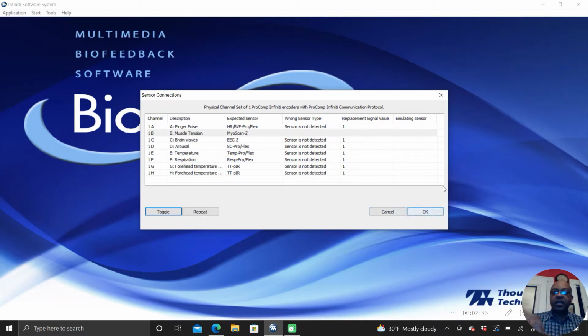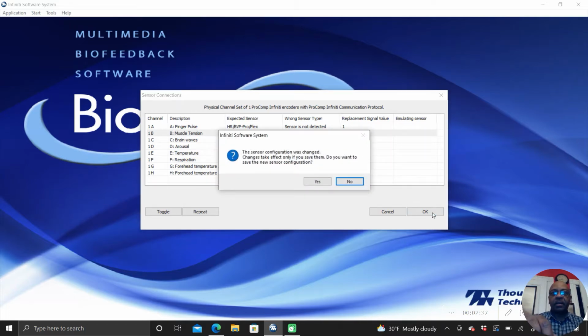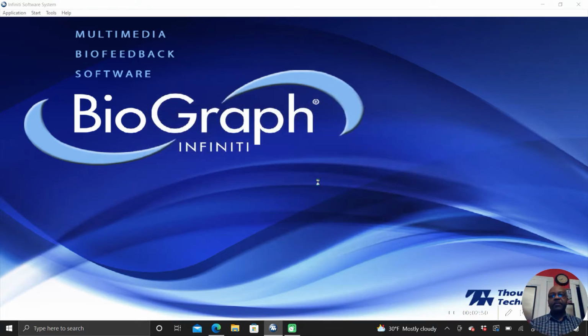So we're actually okay now. I'm going to click OK. It says the sensor configuration was changed. Changes take effect only if you save them. Do you want to save the new sensor configuration? I'm going to say yes.